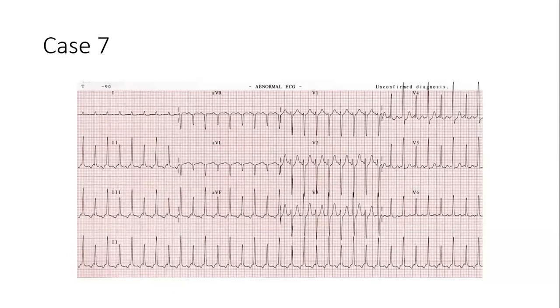So practically, how do you see it? If you are the one going to cardiovert, when the machine is ready, the paper strip will have a dot on top of the R's. If there are no dots on top of the R's, your machine is not synchronized yet with your heart rate, that is with the QRS of your patient's heart.